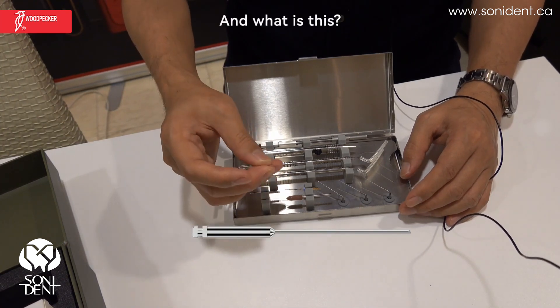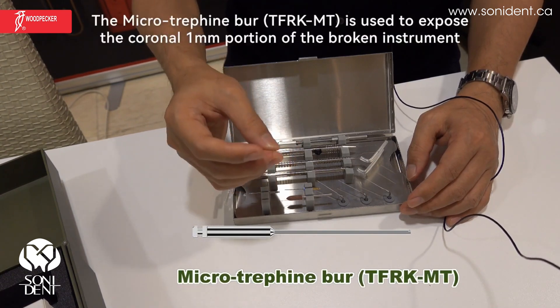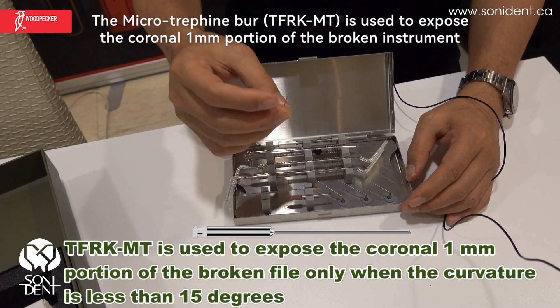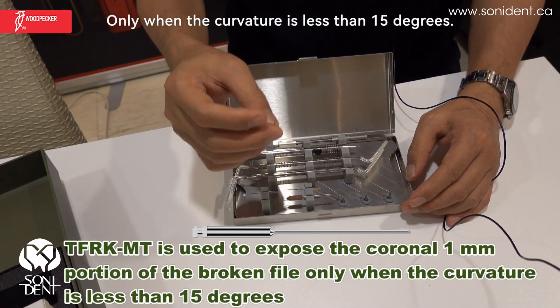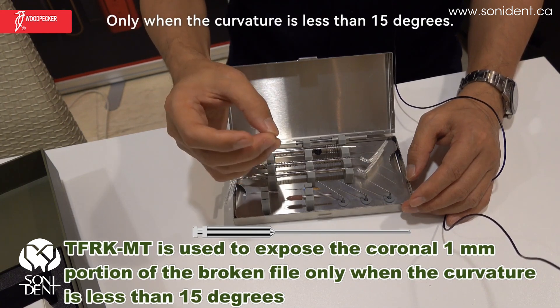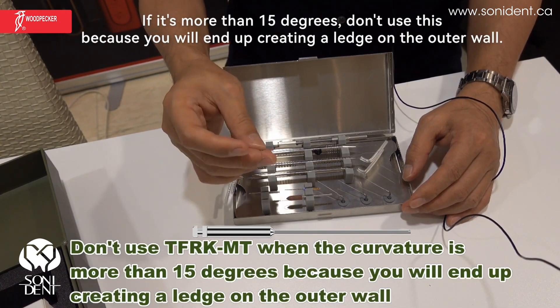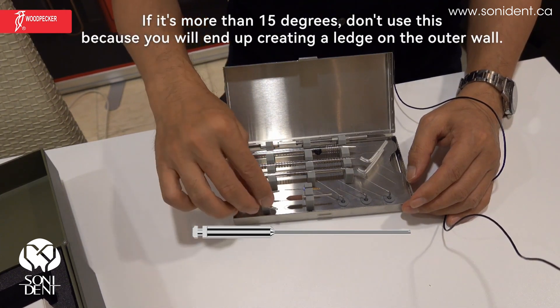And what is this? This is what we call the micro-trephine bur. The micro-trephine bur is used to expose the coronal one-millimeter portion of the broken instrument, only when the curvature is less than 15 degrees. If it's more than 15 degrees, don't use this because you will end up creating a ledge on the outer wall.